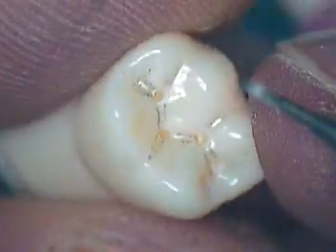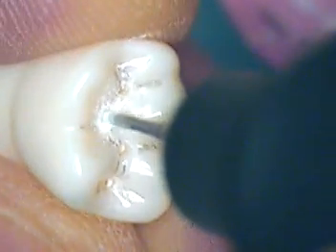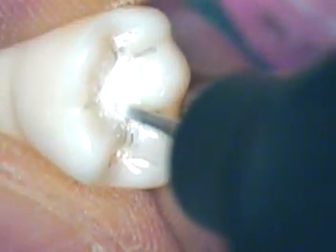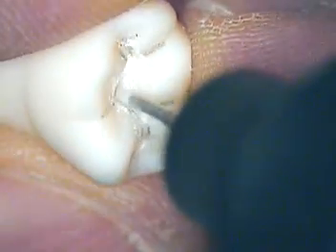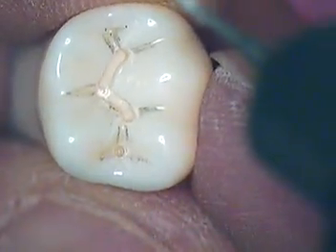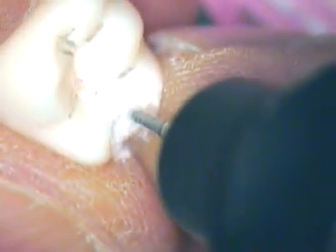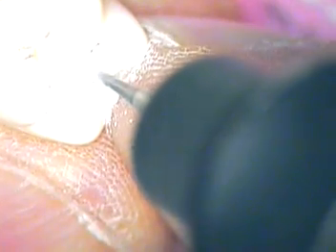So there are my four depth cuts. Now I'm just going to start to connect the dots, as I've done in earlier videos. We'll go to the depth and move — let the bur do the cutting. I'll come up this way. I'm not going straight across; I'm just connecting the dots. So it's going to turn out to be the shape of an M. I'm not pushing vertically anymore, just coming laterally, straight toward my depth cut.